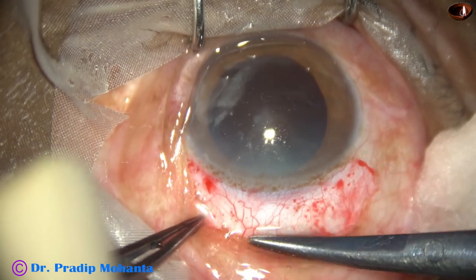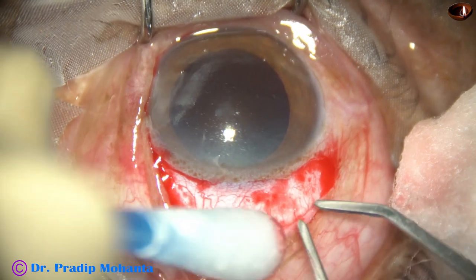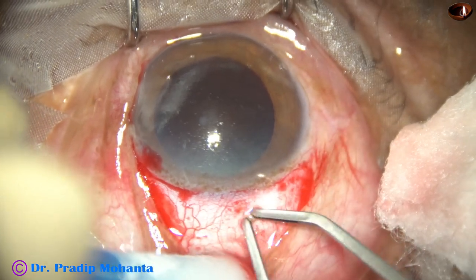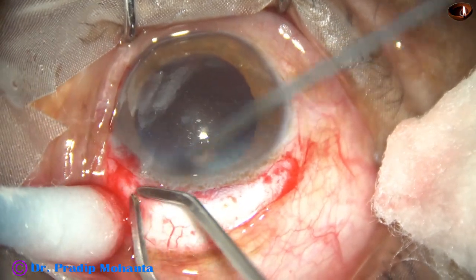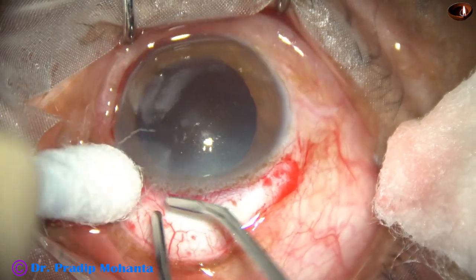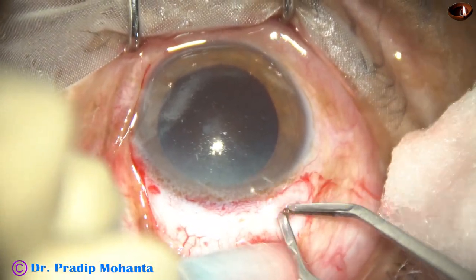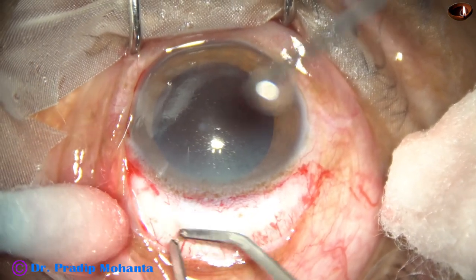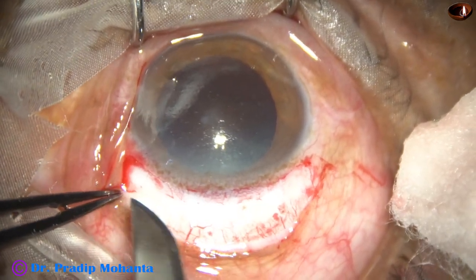By this time, we have applied a superior rectus bridle suture and we have made conjunctival peritomy for about 4 clock hours, from 10 o'clock to 2 o'clock. So, this is about 12 millimeter peritomy. 1 clock hour is almost equal to 3 millimeter. So 4 clock hours means about 12 millimeter. We are going to use about 3 or 3.5 clock hours incision.